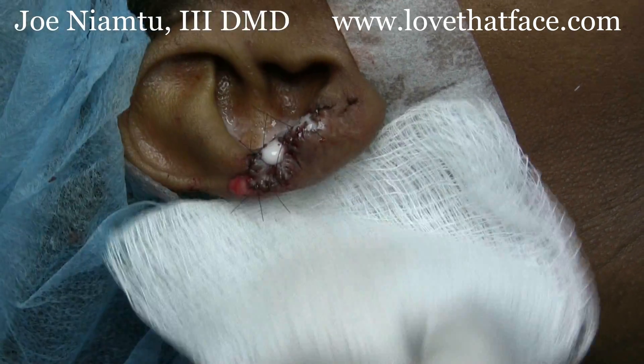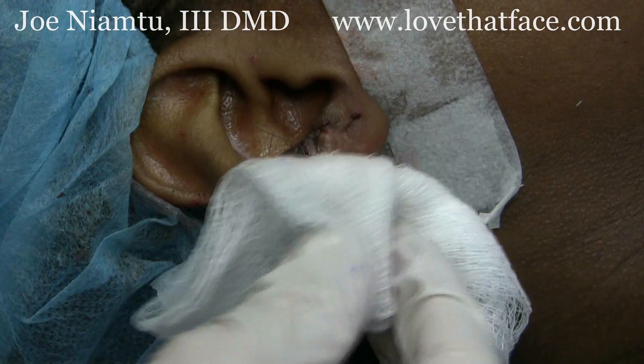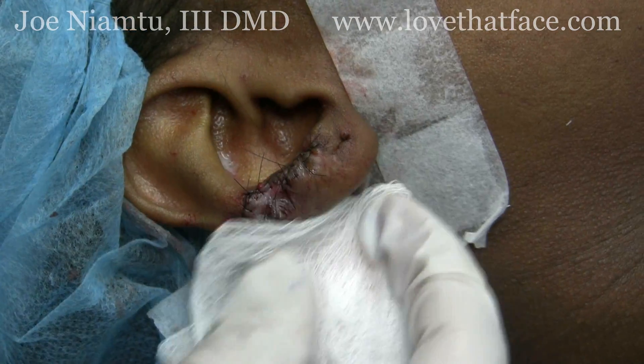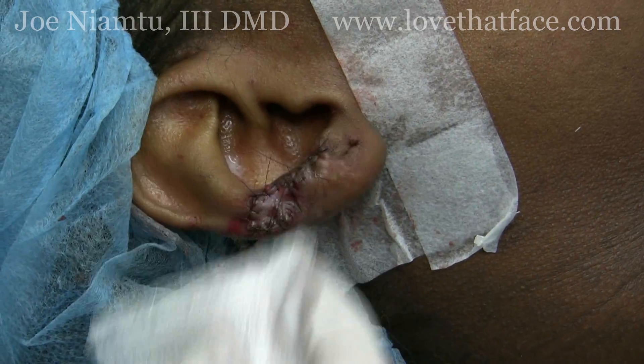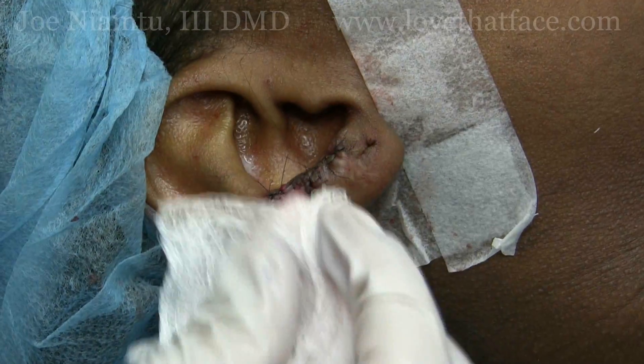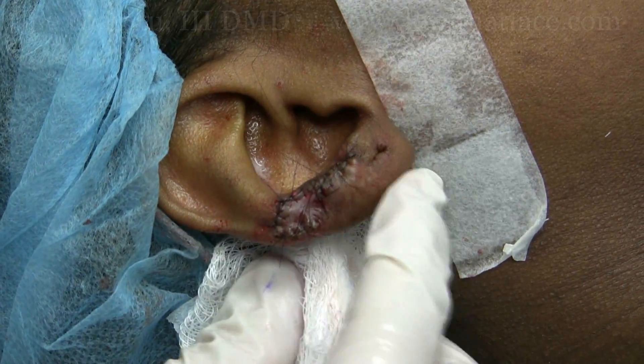We'll use topical steroids and inject this regularly, and hopefully between the excision, the deep FX laser, and the steroid, we will win. This is Dr. Joe Niamt from lovethatface.com showing you an alternate way that we use to treat keloids. Thank you.